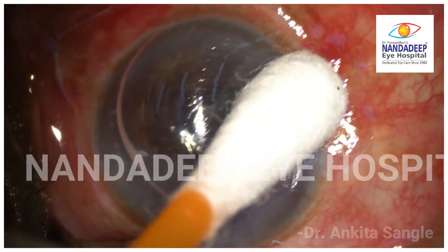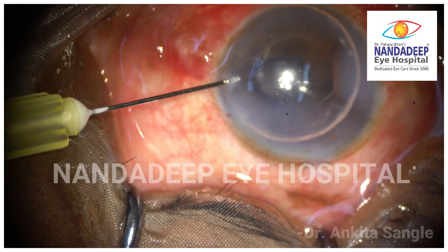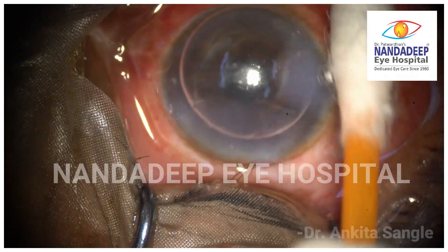While withdrawing the needle, pressure is applied using a cotton tip to avoid the air from escaping and to maintain positive pressure, so as to help reattach the detached Desmet Membrane.